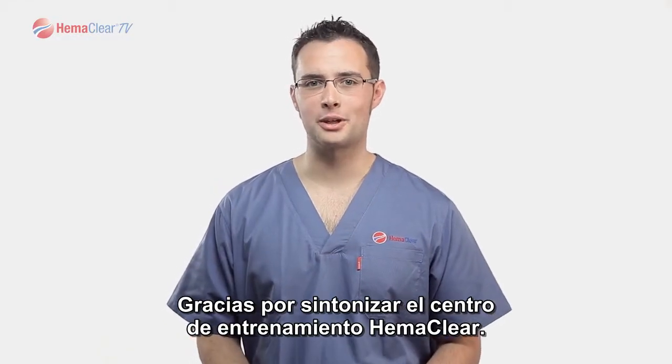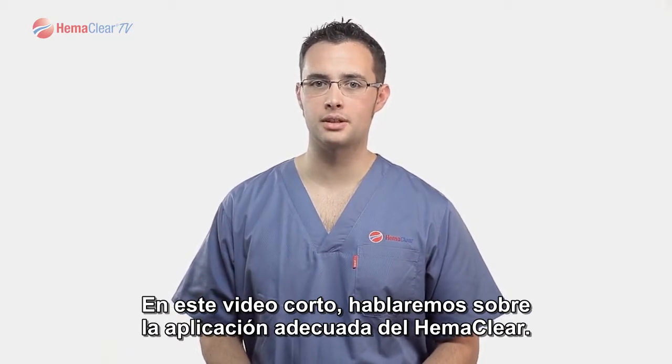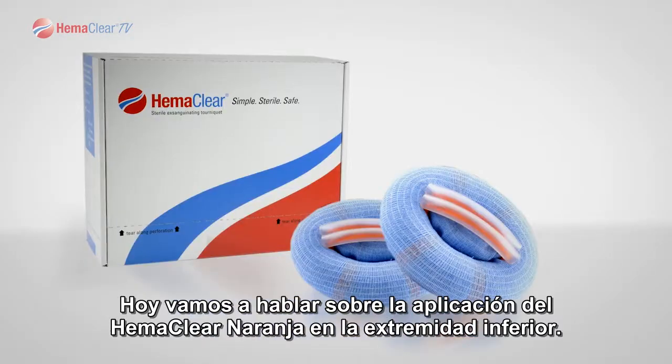Thank you for tuning in to the HemaClear Training Center. In this short video, we'll discuss the proper application of HemaClear. Today we are going to discuss the application of HemaClear Orange to the lower extremity.